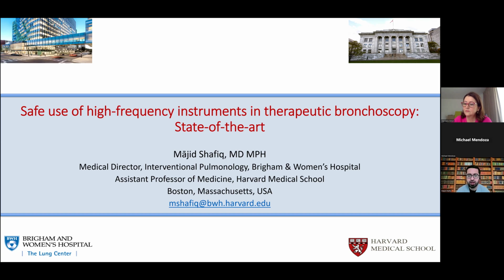But on top of that, I find that the 1.1 also allows me to go much farther out, and it doesn't get hung up on an airway carina as much as a 1.7 or formerly the 1.9 did. So generally, yes, I do like the 1.1 cryoprobe if it's getting me good samples. Thank you very much. Another question.